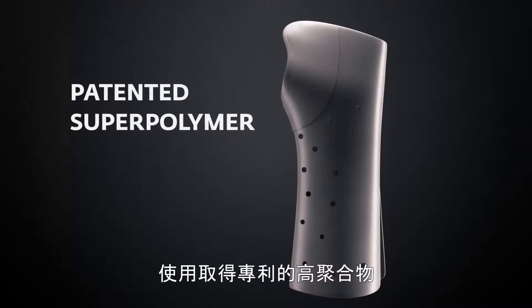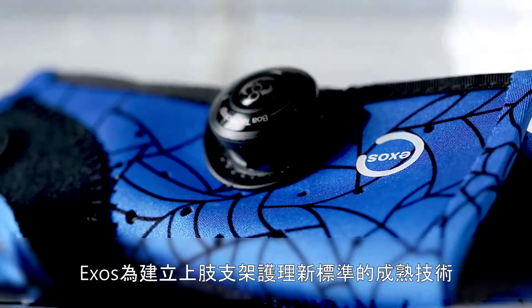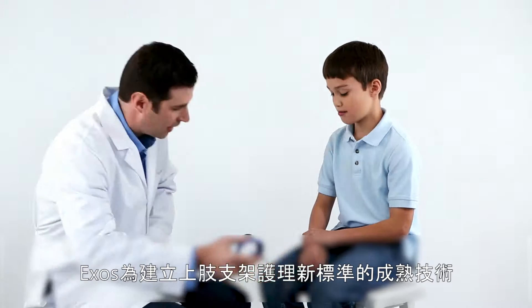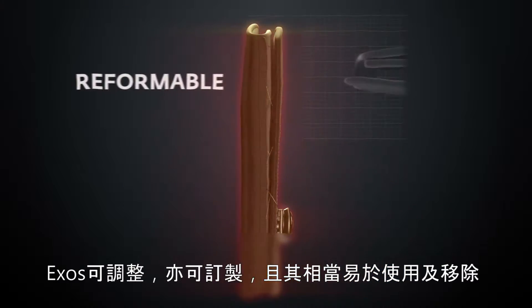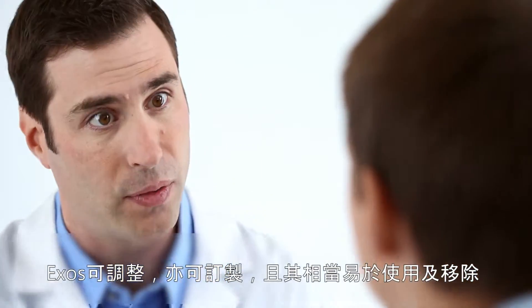Using a patented super polymer, Exos is proven technology that establishes a new standard of care in upper extremity bracing. Exos is reformable and customizable, and it's easily applied and removed.